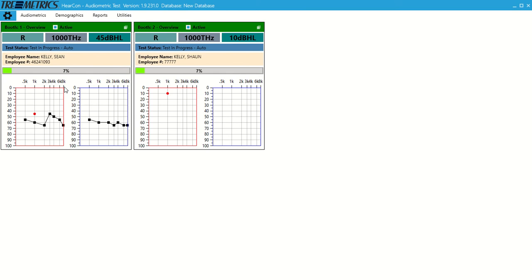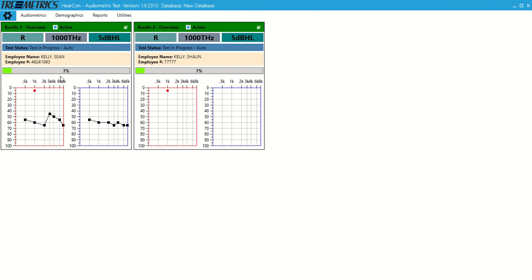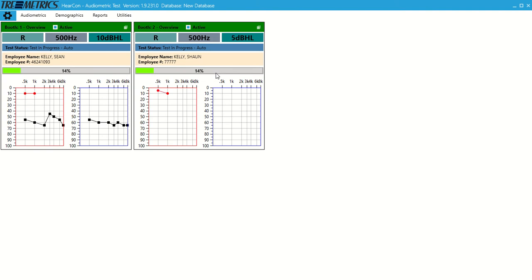You can see over here we just started at 30 because there was no baseline present. This one we had a baseline present and it started right around where the baseline was. We have a progress bar up here too, so 7% of the test is completed. This really shines the further along you get or the more people you have in the booth.